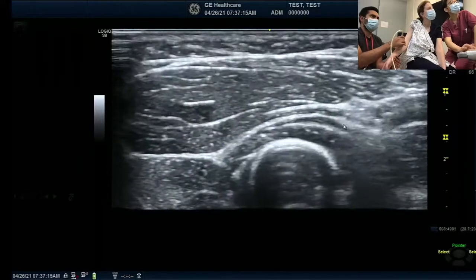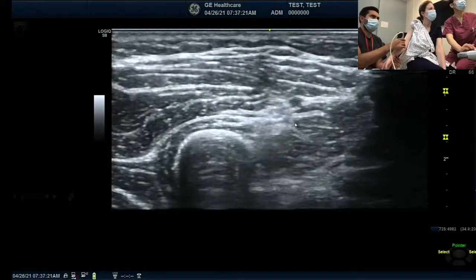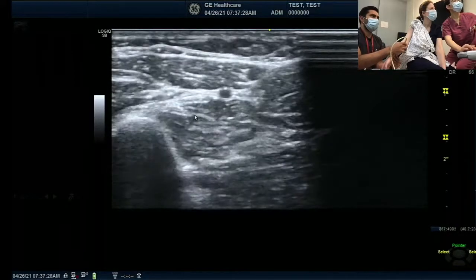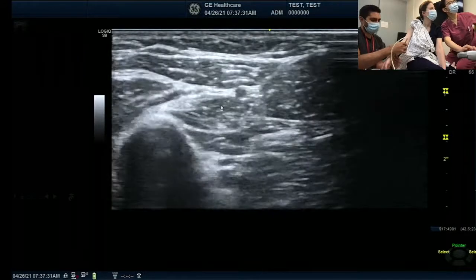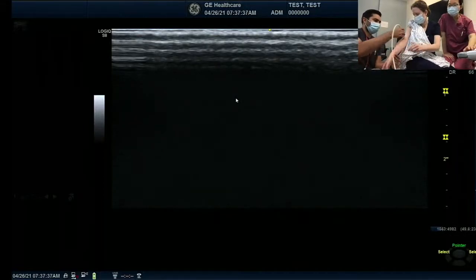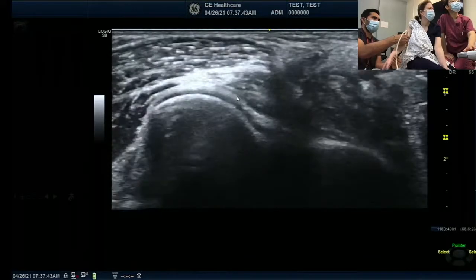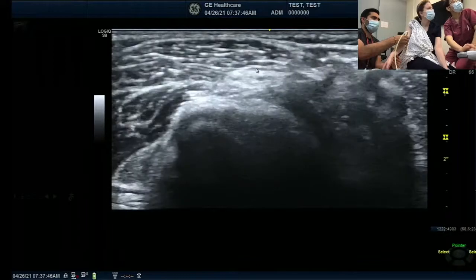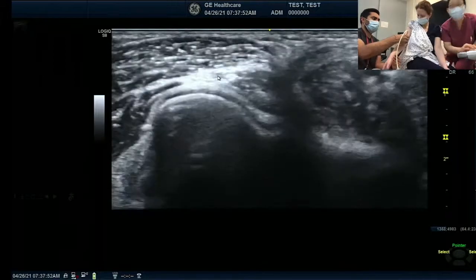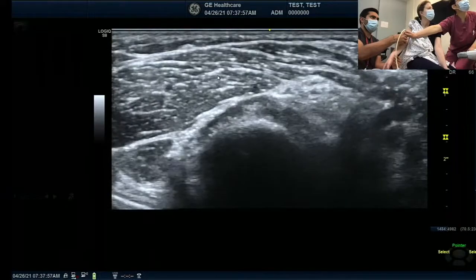Here, here, here. I'm kind of losing it here. It's hard. Where did it go? It's too big. Anterior, right? No, it should be too big. That cannot be. Here. Because I kind of lost it. Almost on the bone. Okay. Let's make it better. Okay. This is the superficial one, right? This one. Can you make it better? I don't know. Here, too, right?